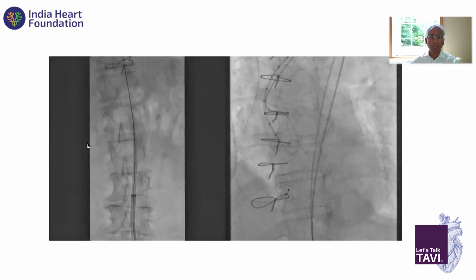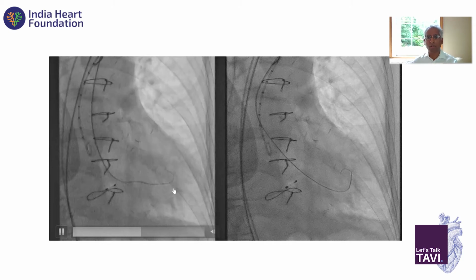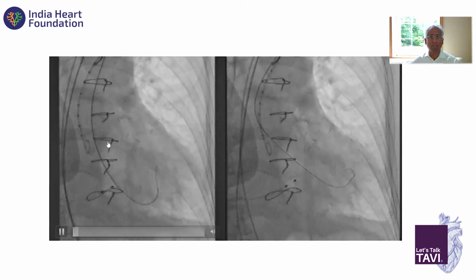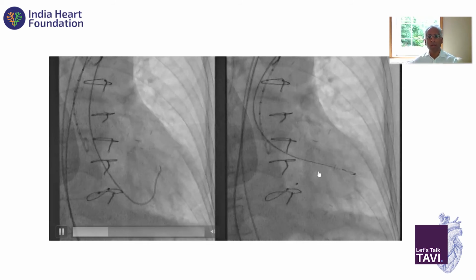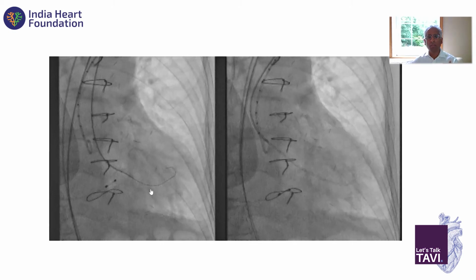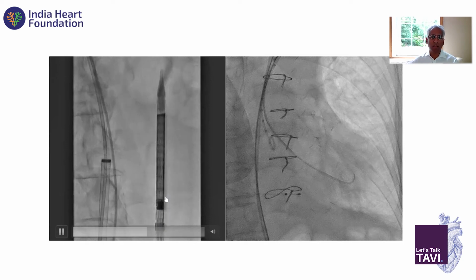And again, another important thing, vascular complication is not just your femoral artery, it's the aorta, it's the left ventricle, and all of this can take you from getting a good result to a catastrophic result. Always, I think once you've crossed the valve, exchange it to a pigtail. And then once you've done that, before you put a stiff wire in the left ventricle, and in this case, the Medtronic valve, make sure the valve is loaded.